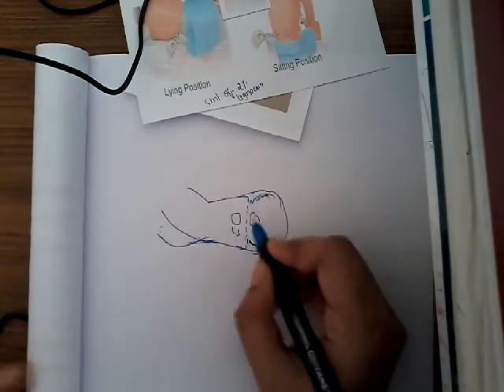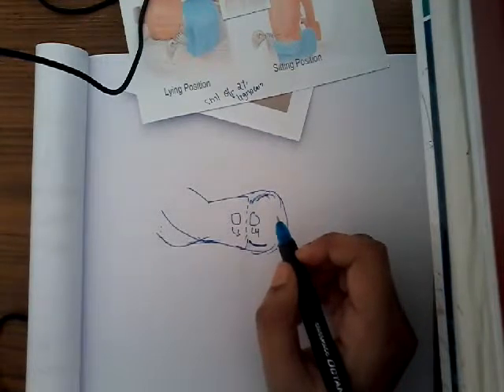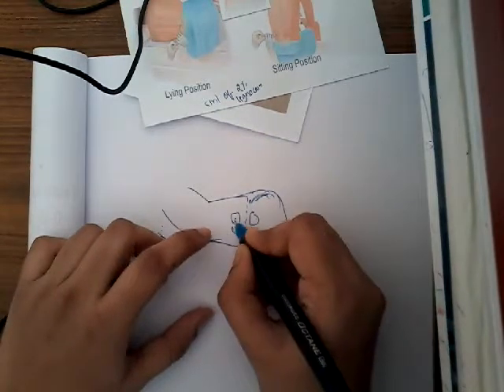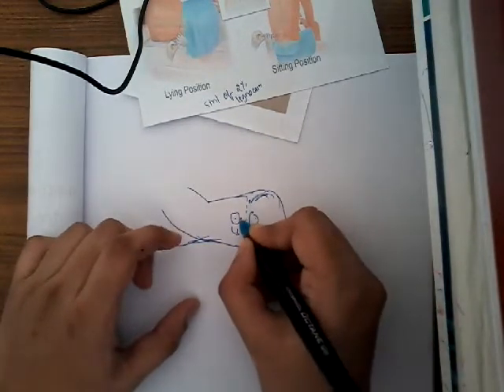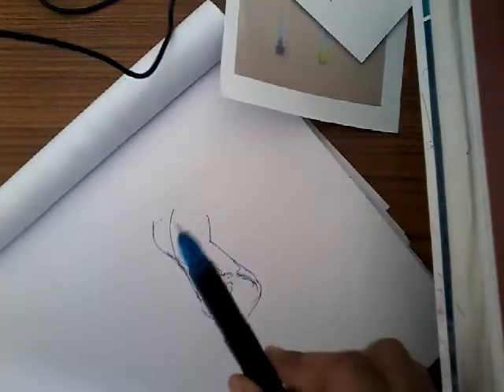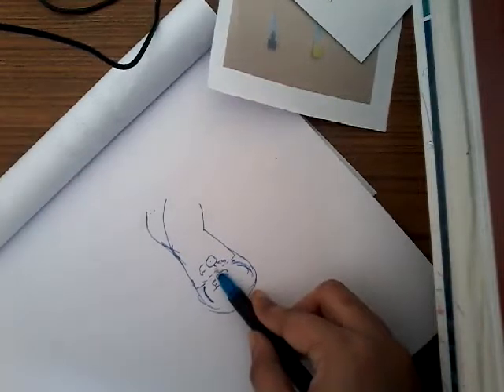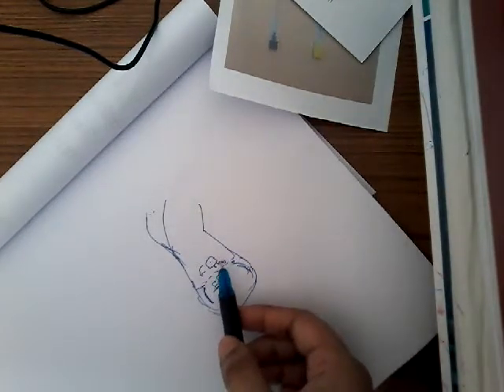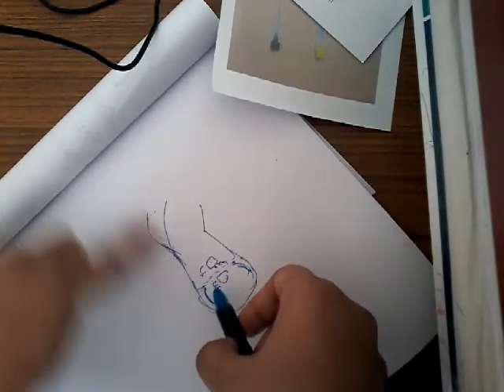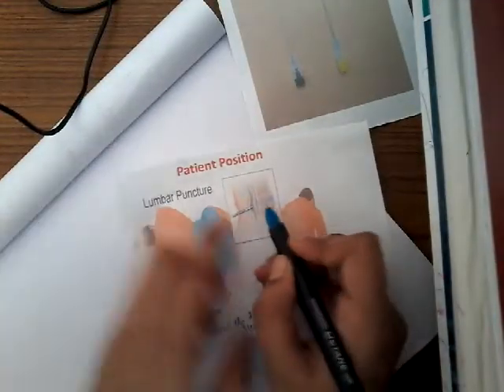You will take the needle and pierce it one centimeter below the spinous process of L3 — the upper vertebra. You hold the needle and pierce the skin. The direction of the needle should be slightly cephalic, that is, angled a little upward.